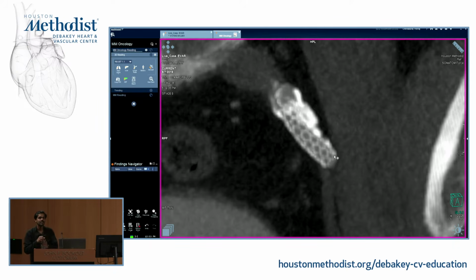Go ahead, please. So the 2 or 3 software options I gave you, say if you have a Mac, Osirix, $0 software can do this. So if you don't have a Mac, the Radiant viewer, if you don't have a Mac, you have to buy a Mac. No, that's what Dr. Lunston told me. I was not a Mac person, so he kept sending me Keynote files every single time when I started working with him. I eventually got to a point where I had to go and buy a Mac.